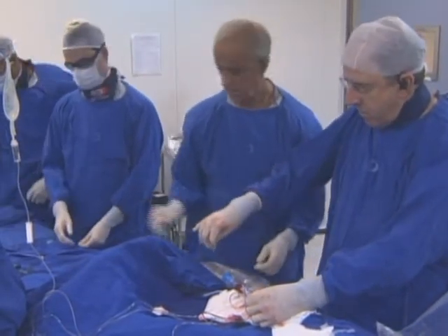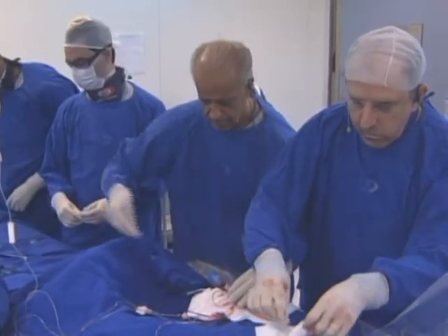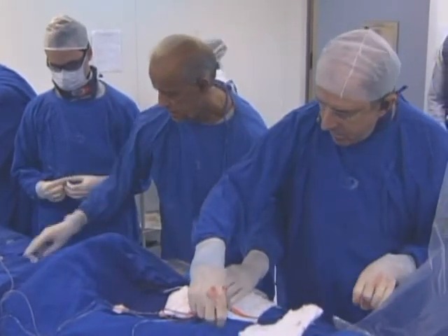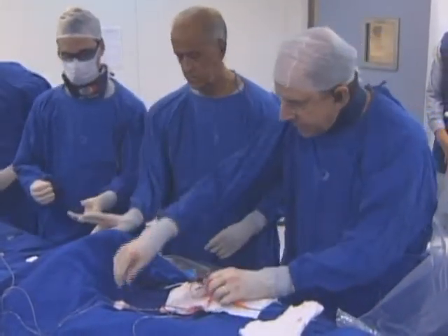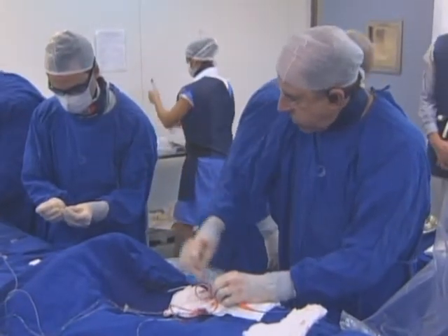Another question is about your technique for pre-dilatation in bifurcation. When you're going to do provisional stenting, I saw very clearly that you did more aggressive preparation, and I would totally agree with you. You pre-dilate the side branch and the main branch, perhaps with a little bit of a smaller balloon for pre-dilatation. But when you do provisional, I want to see Bahar's comments on that.